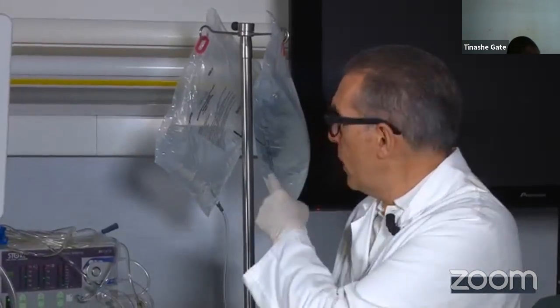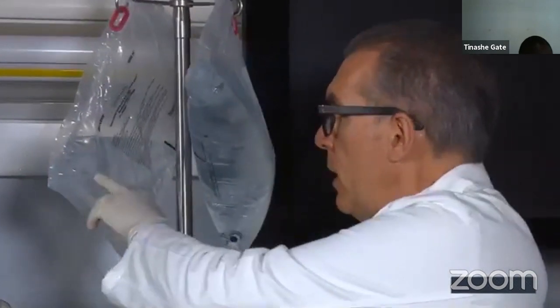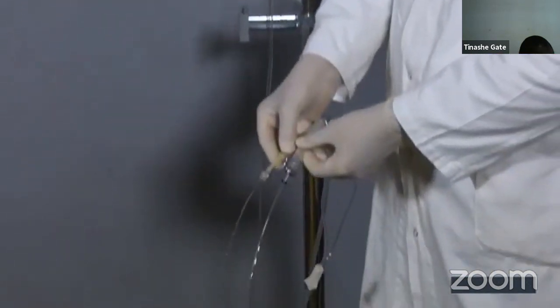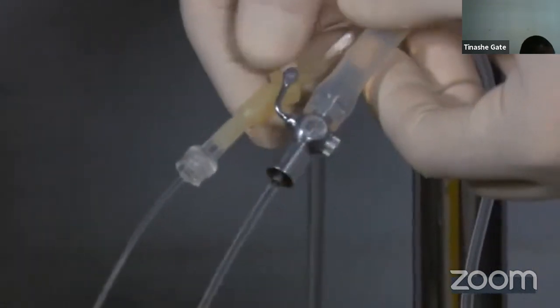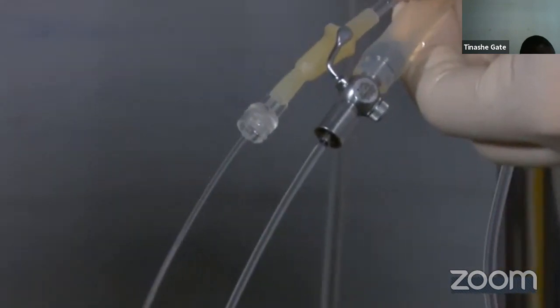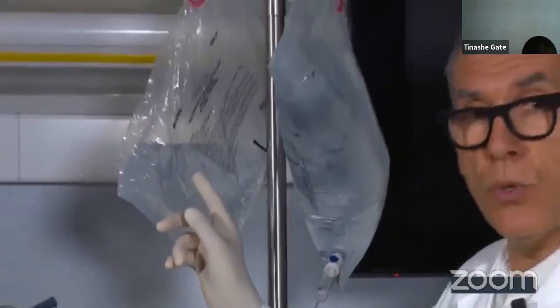So to better explain the concept, I just emptied half of the sac connected to the larger diameter silicone tube, and left the other one intact. So now, as you can see, one still has almost 5 liters, and here probably around 2.5 liters. Watch what happens to the flow. If you compare with the previous flow, you will see that now the two flows are very similar. Why? Because the gravity pressure is acting on this 5-liter sac at full strength, while on this one it is acting not on 5 liters anymore, but on 2.5 liters.